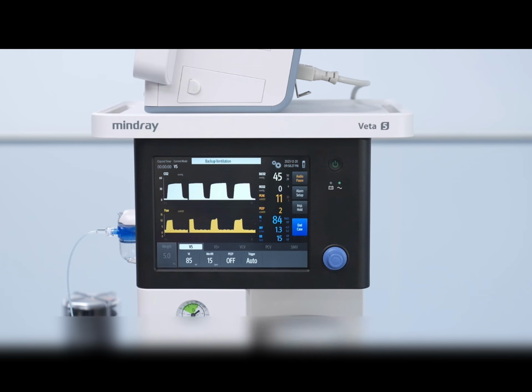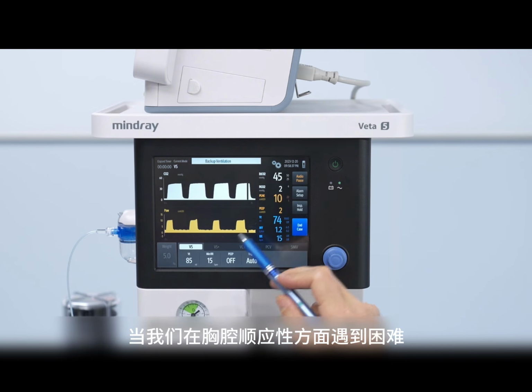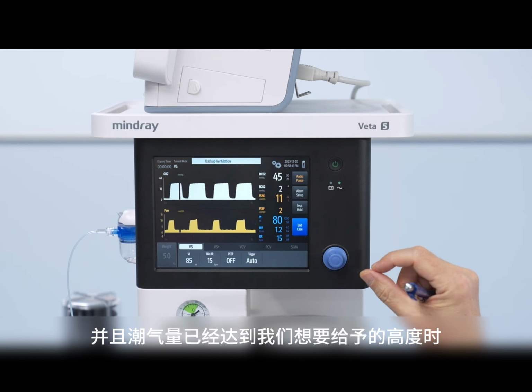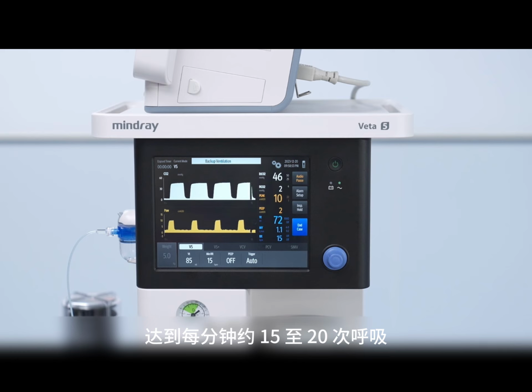However, we should make an effort to mitigate the increase in tidal volume, and in such cases when we are having difficulties with chest compliance and the tidal volume is already as high as we want it to be, then we should increase the respiratory rate, maybe higher than the normal range, towards 15 to 20 breaths per minute.